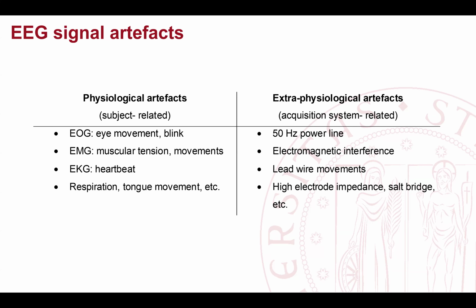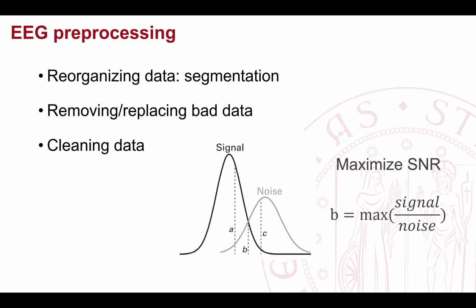So I will try to remove the EOG, that for sure will be present, EMG, that will be present, and the 50 Hz power line noise. So these three normally are always present. The other ones, it depends on your problem.